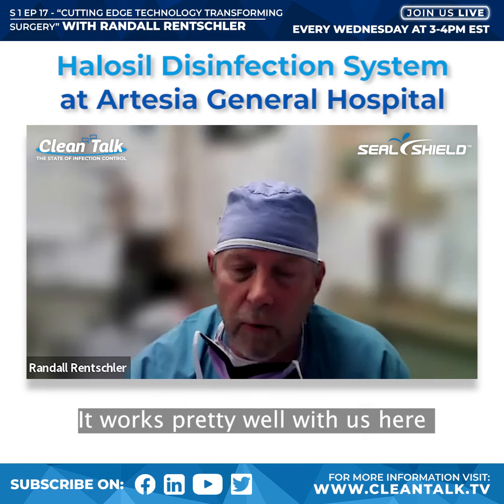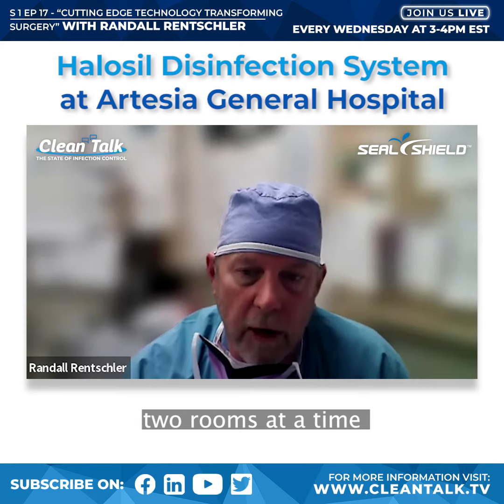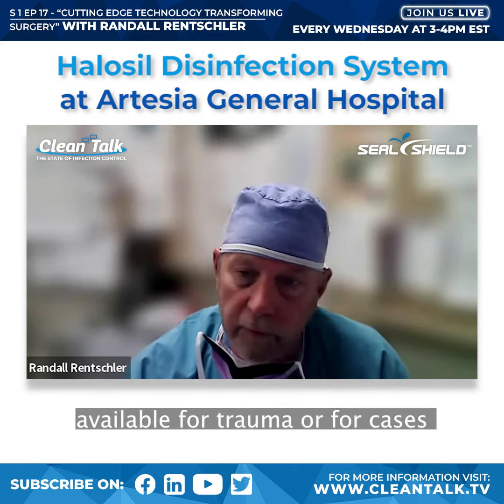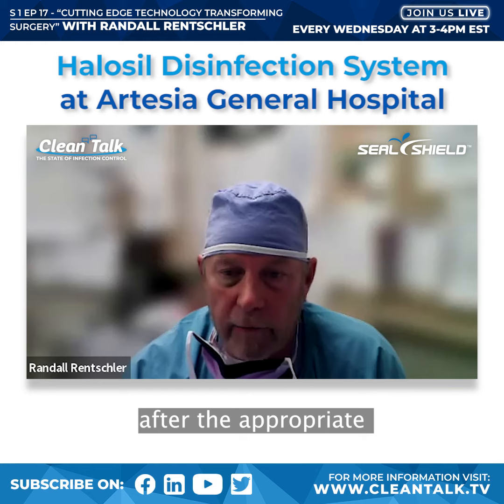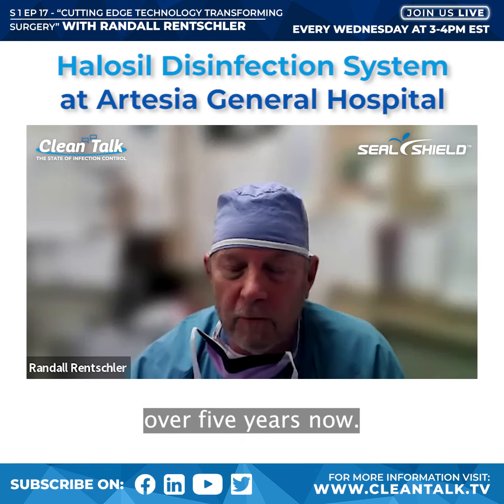It works pretty well with us here based on our surgical load, and we can easily shut down 2 rooms at a time, fog 2 rooms at a time, and then have the other 2 rooms available for trauma or for cases that we still have pending. And then we use our HVAC system just to be evacuated out after the appropriate dwell time, and we go back in. So we've been using it for over 5 years now.